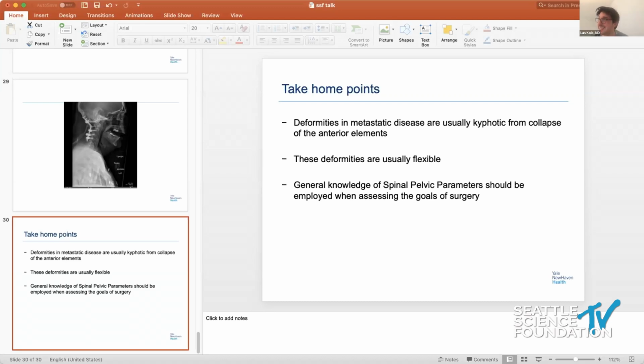Yeah. I think that it definitely can provide some support. In some of my experience, I've seen some of them not fully fused. I've ended up taking one of them out. Some of the fibular grafts post-op were just going to hang out there. I think meticulous decortication and putting in your bone graft can be extremely useful.